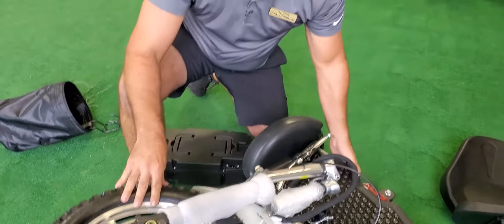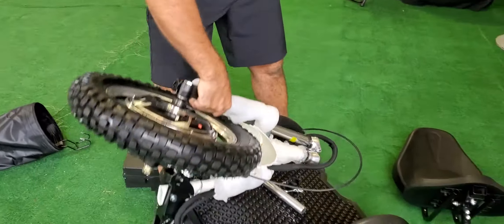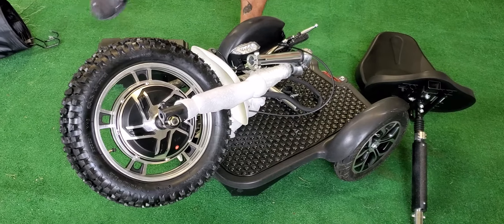It does have a small wheel so you can move this. With it like this it takes away a lot of the weight — a lot of it. That's it!